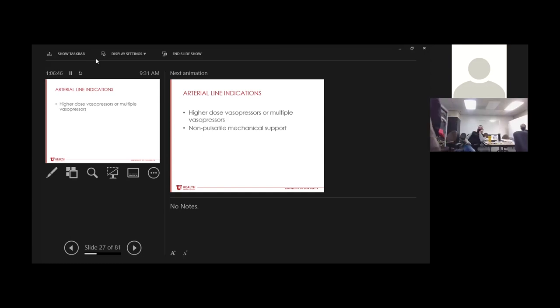It takes about 2 seconds before it's stable. So that's another thing that we'll work on hands on. It just depends, and that's totally appropriate for some patients. It's just good to know, but that's an option.